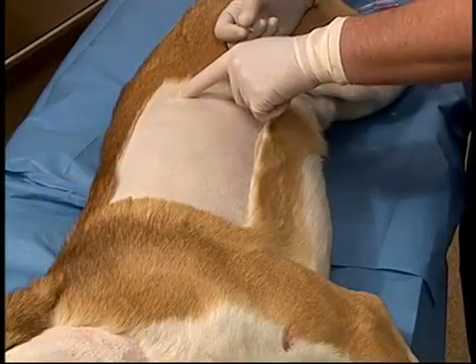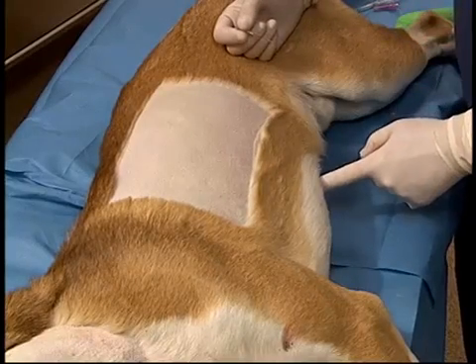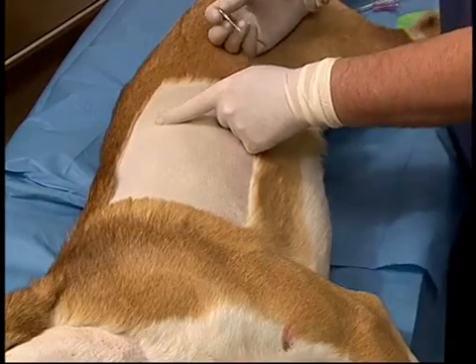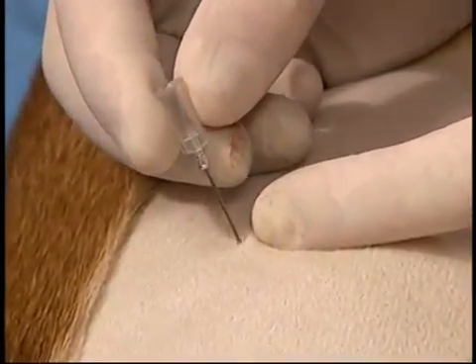Thoracentesis is performed at the 7th and 9th intercostal space. Ideally this should be counted, but in an emergent situation an imaginary line can be drawn from the xiphoid directly dorsally. This will be in the appropriate location. The needle is inserted into the skin — the dorsal third for air, ventral third for fluid.